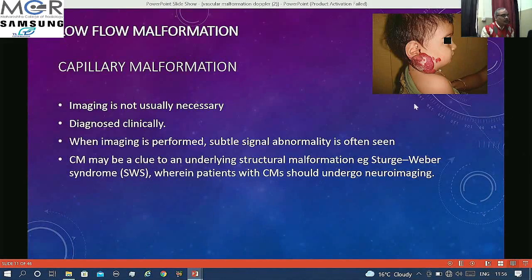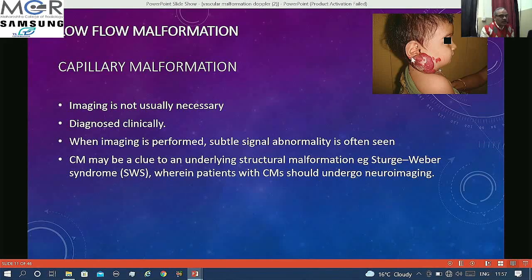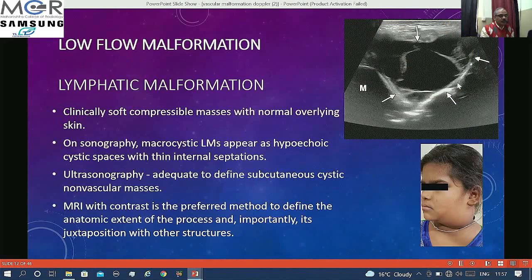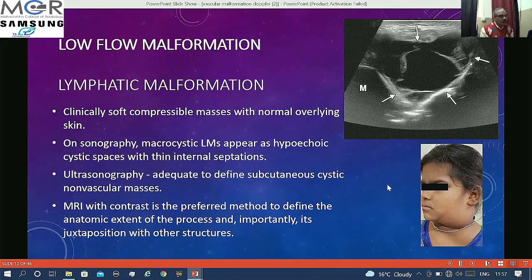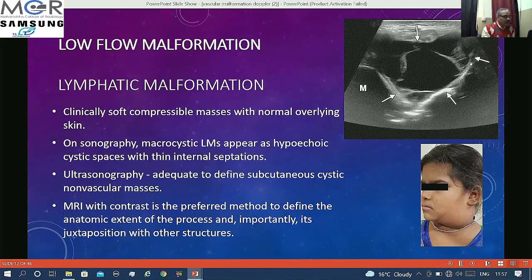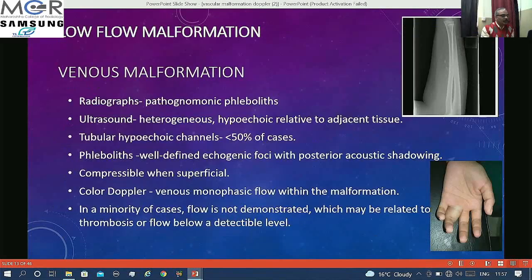As an example of low flow malformation: capillary hemangioma imaging is usually not necessary, but if you do ultrasound you may see very minimal signal abnormality. If such hemangiomas are seen, CNS involvement may be evaluated to look for Sturge-Weber syndrome. Lymphatic malformations appear cystic with septations and can assume large sizes but are soft and compressible. The macrocystic type shows cystic spaces with septation; ultrasound is adequate to define the plane and is quite diagnostic in diagnosing lymphatic malformations.